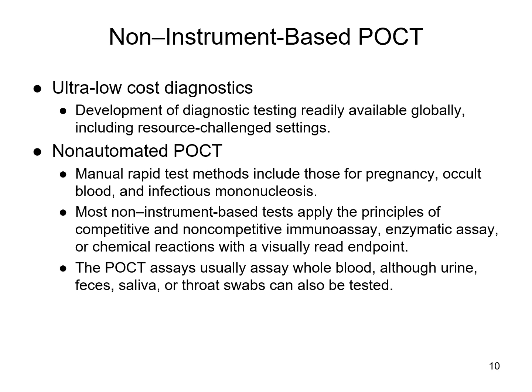And usually the sample for it is really easy to collect. Sometimes you can use whole blood from a venous puncture or a finger stick. Could be urine, feces, saliva, throat swabs, checking for strep. So these are non-instrument based.